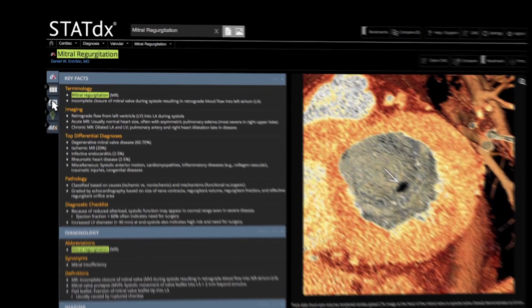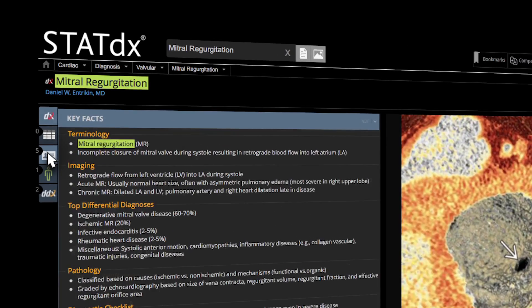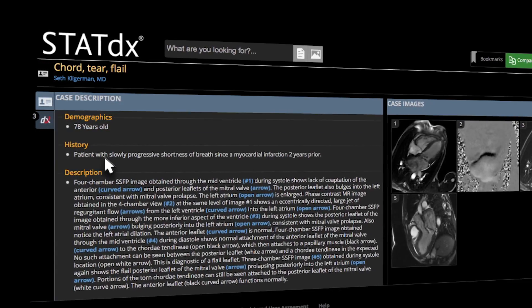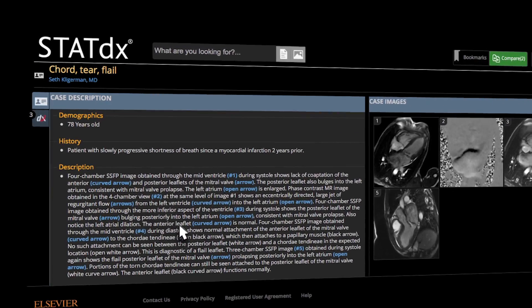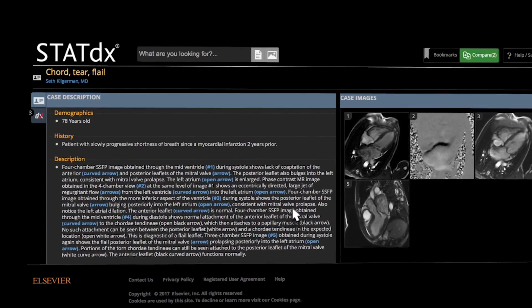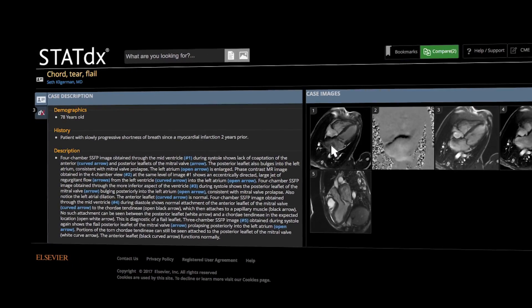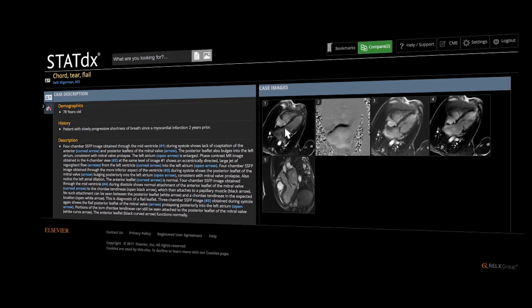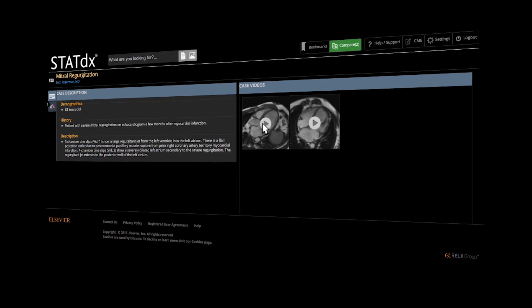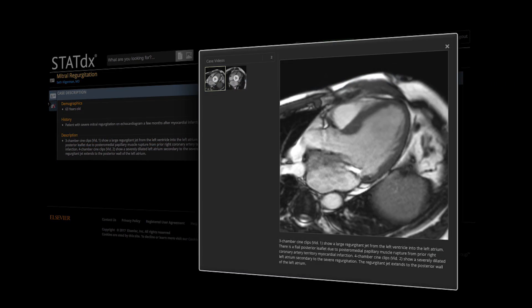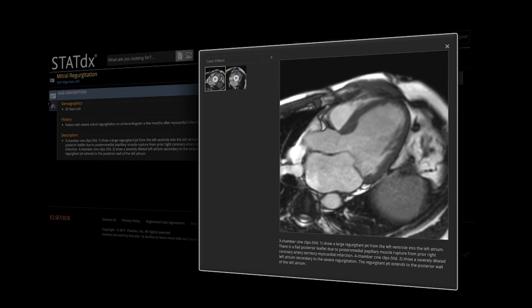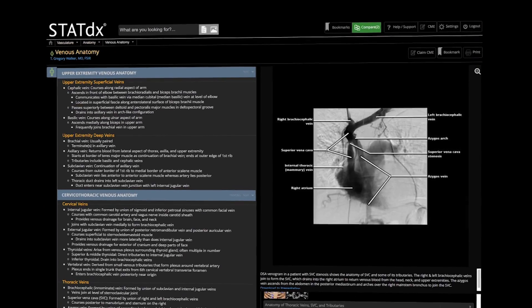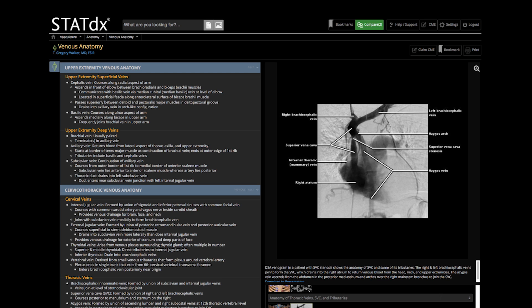Many diagnoses are further supported by individual patient cases. Each case includes the patient's demographic, history, and case description, along with a series of detailed images. The images are also supported by annotations from an expert in that field. Many cases include video clips, also called cine clips. When applicable, related anatomy information is also included.